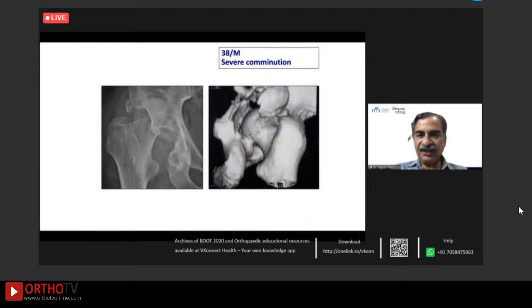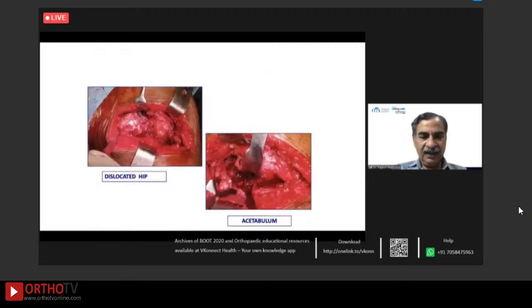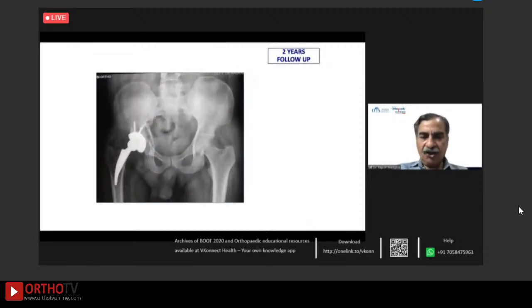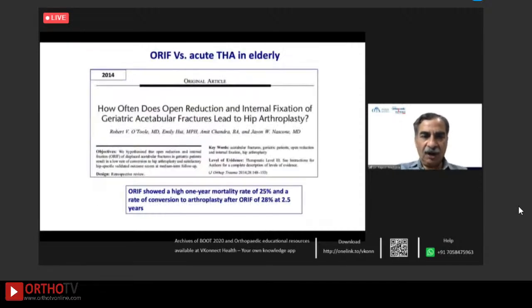So this is a case which had severe comminution, 38-year-old male. The hip was dislocated, and it could be wedged between the two columns and could get a stable intraoperative fixation, and this is the follow-up. So how often does open reduction internal fixation of geriatric acetabular fracture lead to hip arthroplasty? This seminal paper showed that one-year mortality was 25% and rate of conversion to arthroplasty after ORIF was 28% at 2.5 years for the geriatric age group.